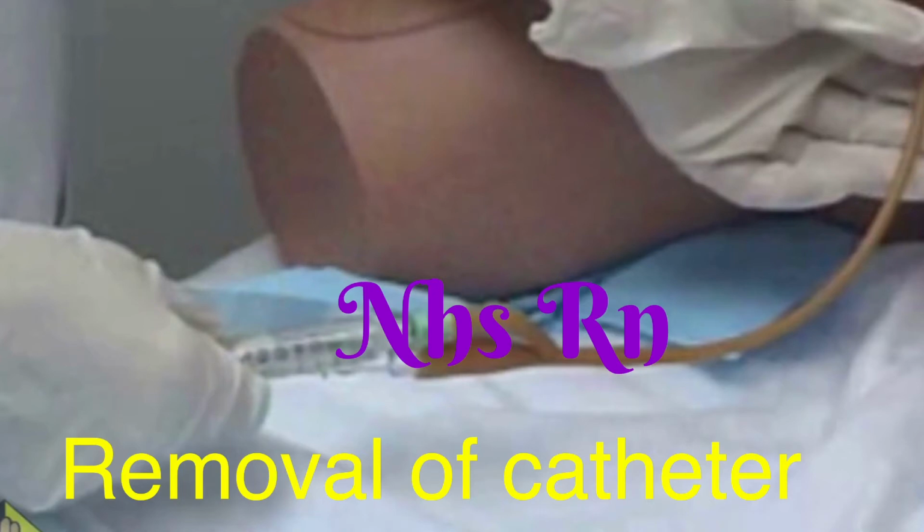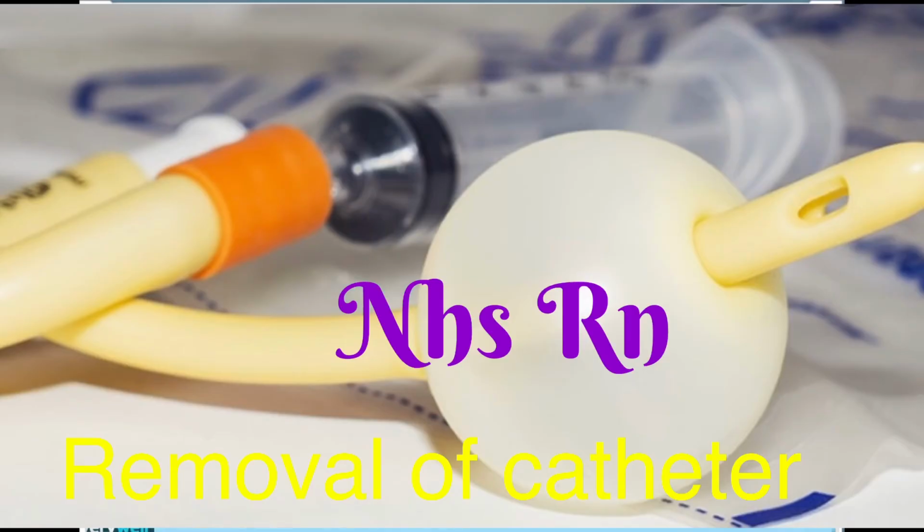Then you need to hand wash or hand gel. I would prefer hand wash. Throughout the procedure, washing hands at least once is good practice, so do a hand wash at that time. Then after you hand wash, put on an apron and a pair of gloves. Because this station is in the same place, you are just turning back, so you don't need to move to any other room and come back. So just put it on there. Put on an apron, put on gloves.